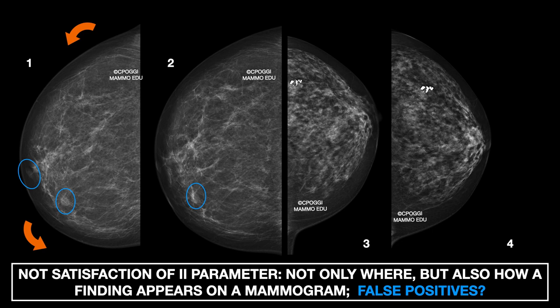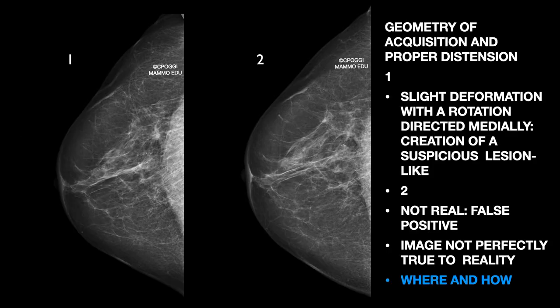Let's consider now images three and four. In three, again rotation, this time directed laterally. Is this finding real? Repetition in image four, more correct: the finding seems to have disappeared — that is, it was a false positive. Again, a rotation directed medially — you see the ojival shape. This finding appears as a spiculated one. Repetition in image two with a more correct acquisition geometry, and the finding has disappeared.